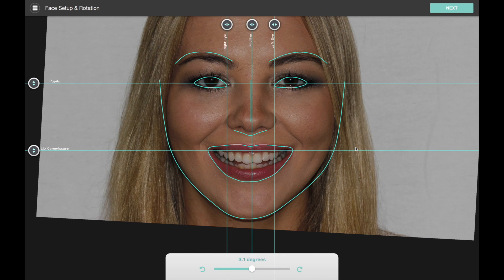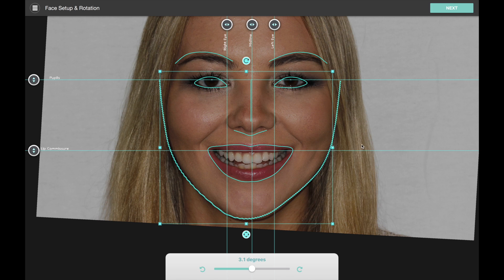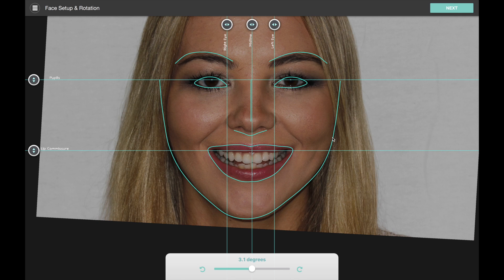Now we're setting up the face. The software has found features on the face automatically — this is a feature we call Auto Assist, available with a premium cloud subscription. It helps you to first straighten the photo, and it also tells Smile Designer where important landmarks on the face are, which really helps the software automate and accelerate the workflow. If you're not on a premium cloud plan you'll have a manual workflow to step through to define these features, but with Auto Assist this is completely automated. We want to set up the midline where we want it. The software just needs to know roughly where the eyes are and where the mouth is.